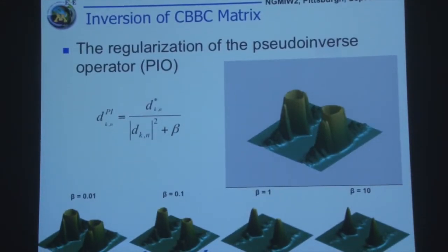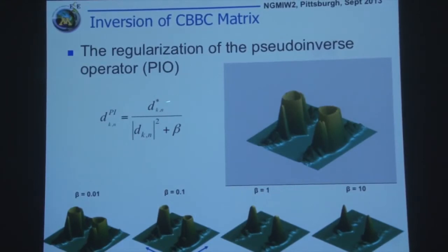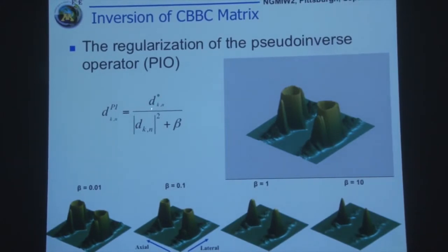It also leads to a very well-behaved regularization procedure. The diagonalization process that I mentioned results in the Fourier coefficients in axial and lateral direction, given in terms of the diagonalized elements of this large matrix. These can be obtained through a two-dimensional Fourier transform of the received data from a frame, for example, a linear array frame. Depending on the value of beta that I use, if beta is very small, I get inversion in the main band of the transducer in the two-dimensional space. These are lateral frequencies and axial frequencies. And if I ease up the values of beta, I move more and more towards a matched filter.